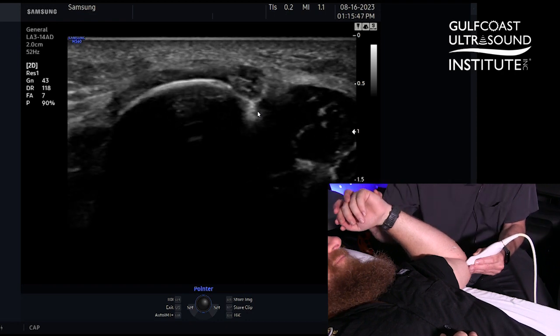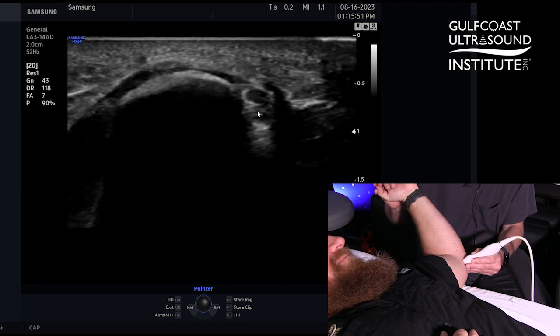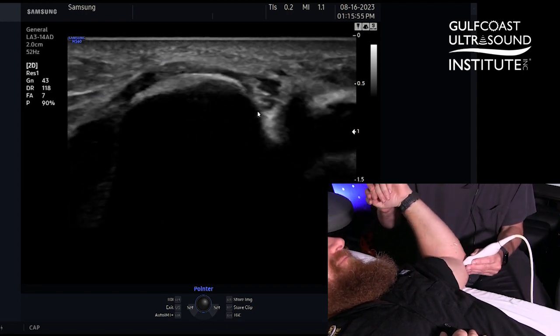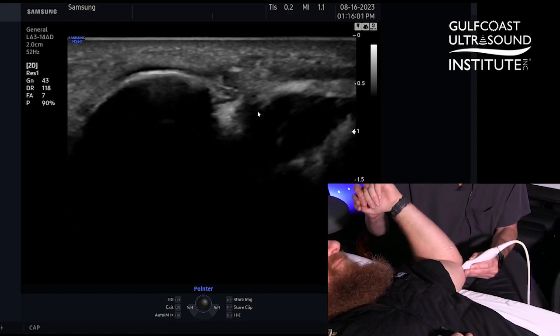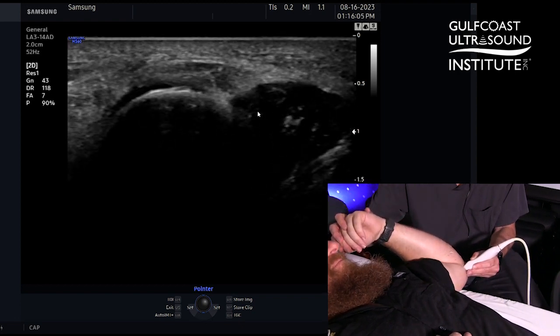Looking at this dynamically can be very important to identify a subluxing nerve and any kind of compression from that movement. We can do flexion and extension, and by fixating on the medial epicondyle with our transducer, we can get a nice image to see what happens to that nerve in short axis dynamically.